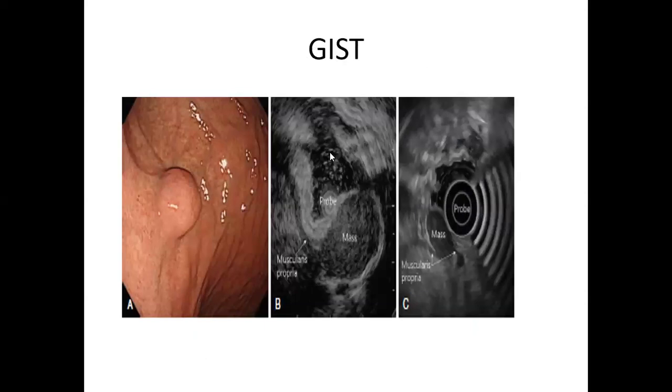So the picture at the far left is a gastrointestinal stromal tumor. Like I mentioned in my preamble, when we are doing conventional endoscopy, we are supposed to get a biopsy here, but our forceps are just able to get the mucosa. Now this mucosa looks normal, so we're not able to get inside this lesion.